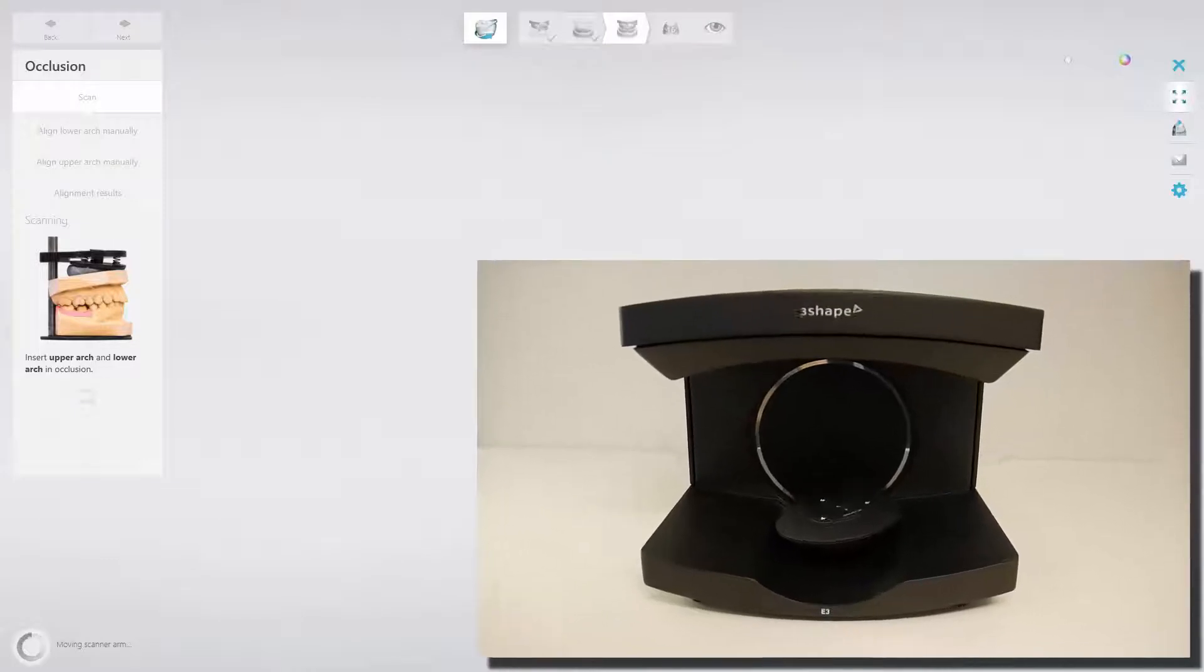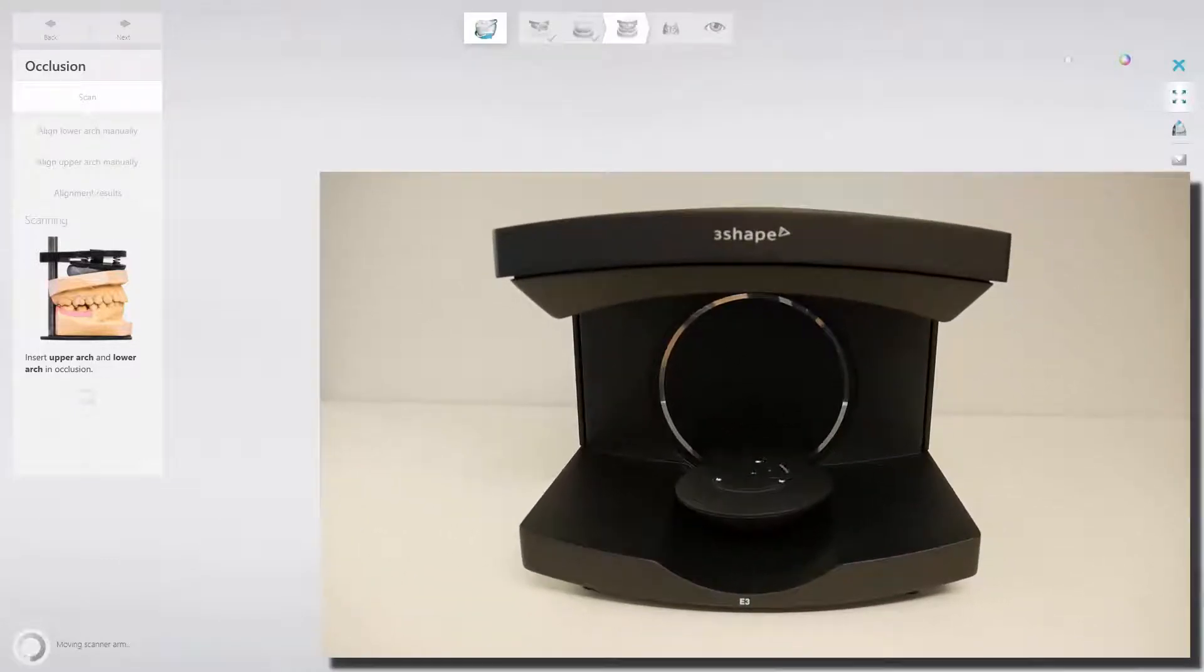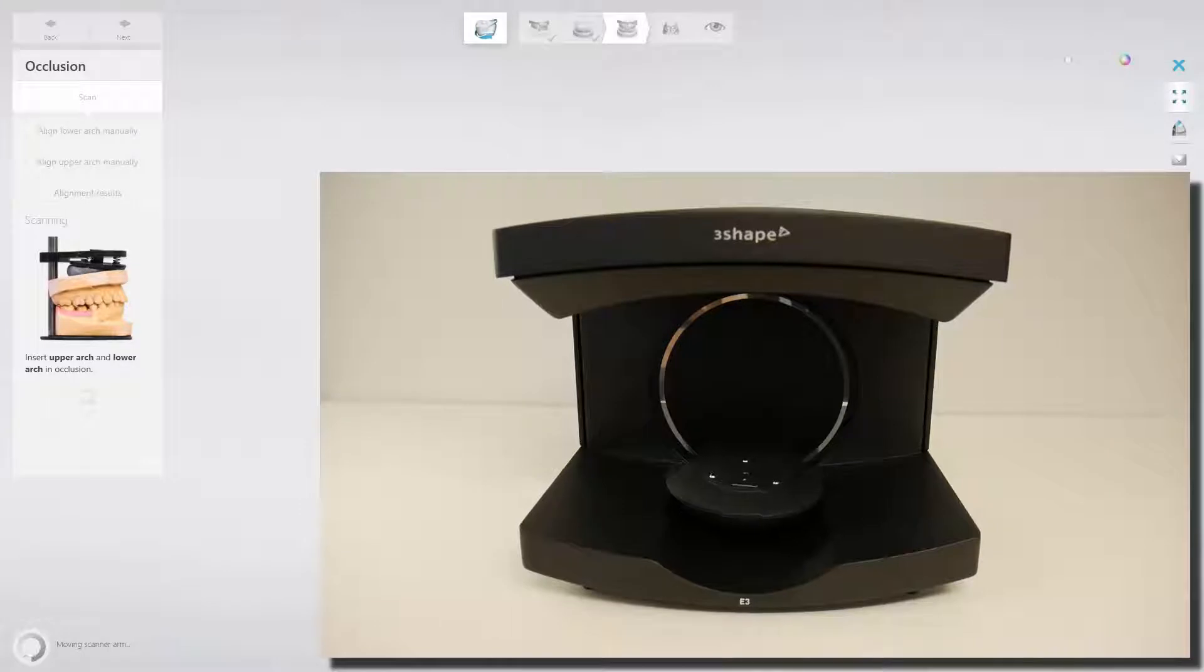To allow occlusion scanning, the arm will move to a new position to accept the Articulator Holder.